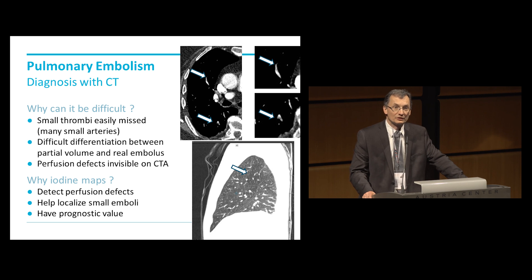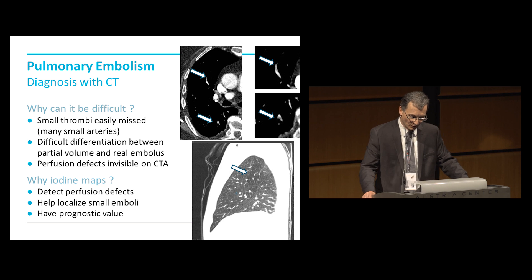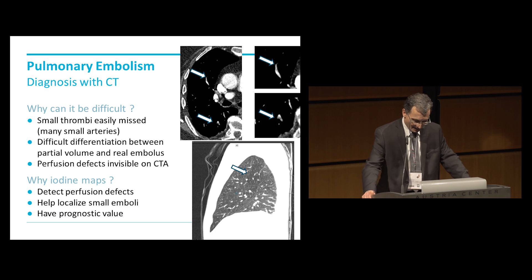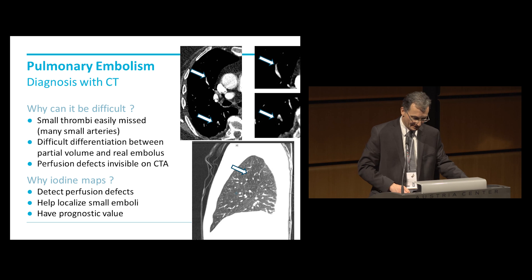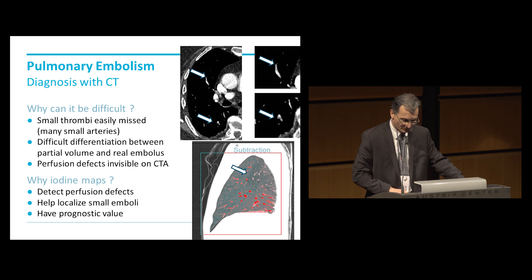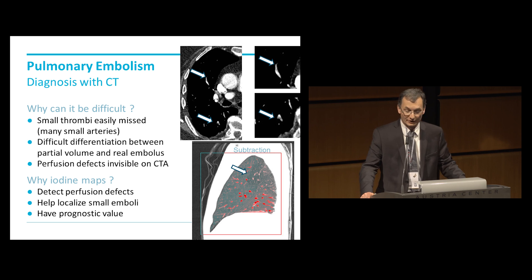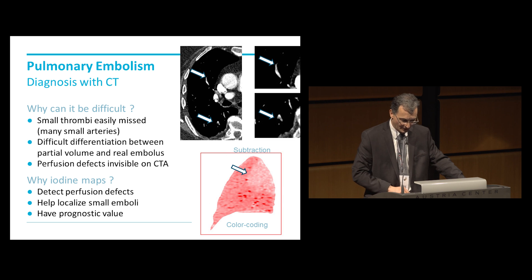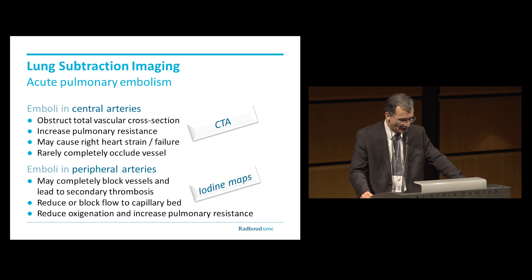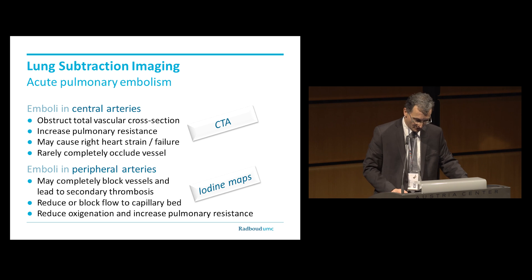We all know that it sometimes can be difficult to detect small emboli. Thanks to partial volume effects, you're not really sure if this is really an embolus or just a partial volume effect — sometimes you just easily miss those. For example, this was an embolus which was not described. Now if you look at perfusion maps, you see differences in enhancement, and it can help you localize small emboli. We also know that they have a certain prognostic value — the more areas are affected, the worse the outcome for the patient, or the bigger the risk for right heart failure. Emboli in central arteries are easily detected by CTA, while emboli in peripheral arteries are probably more easily detected using iodine maps.